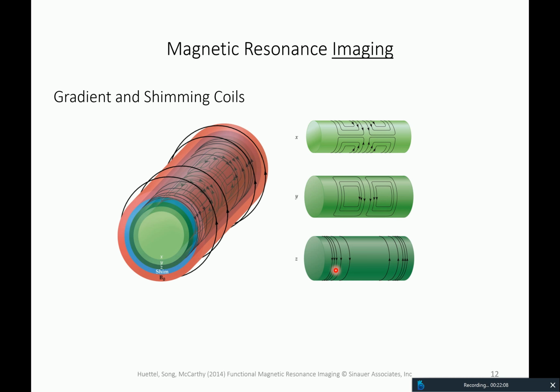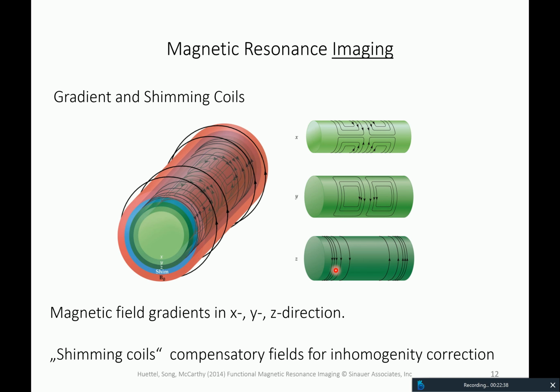When you run imaging procedures on the MR scanner, there's usually a shimming part where you hear the shimming coils being adjusted as a kind of characteristic noise, because all of this makes some noise. And you also don't get images then, and people would say, this is just the shimming, and okay, that is there to make the magnetic field homogeneous, because that's important for the imaging process. And this is what I just explained.